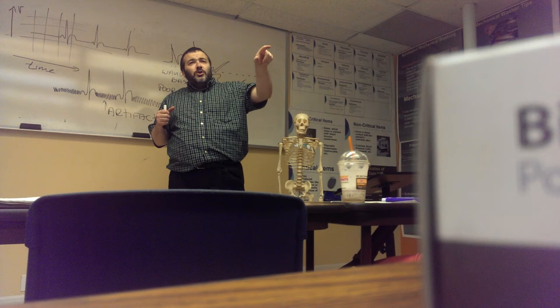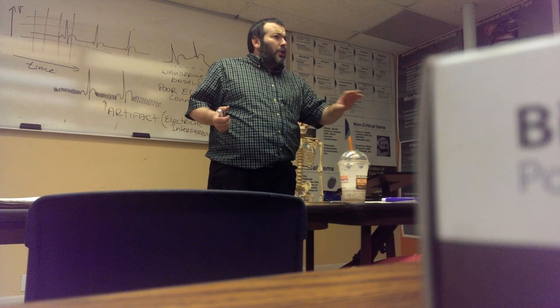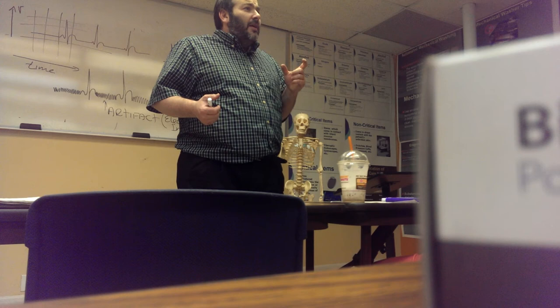And more importantly, you do an EKG, your patient has a phone, the doctor has a phone, the three of you are in the room and you have a phone. Ask the patient to turn off their phone. Absolutely. Not ask, but definitively tell them to turn it off, or leave it outside with the relative or whatever. Okay, makes sense?